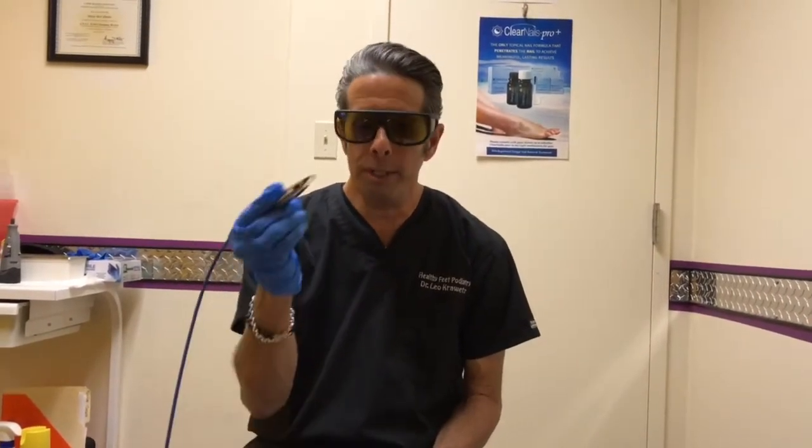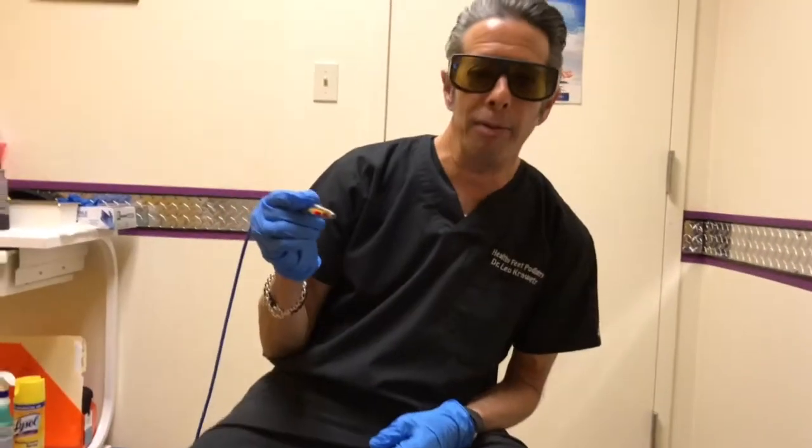Hi, I'm Dr. Leo Krowitz at Healthy Feet Podiatry. At Healthy Feet Podiatry we're able to offer laser toenail fungal treatment. We use the Diowave laser and I'm going to demonstrate how this works.